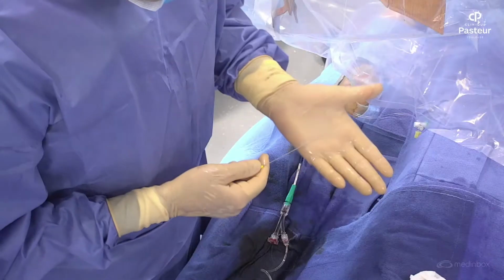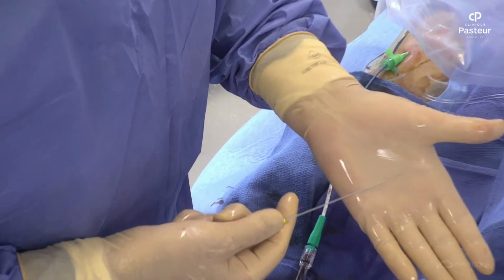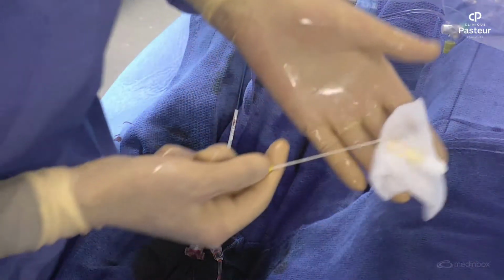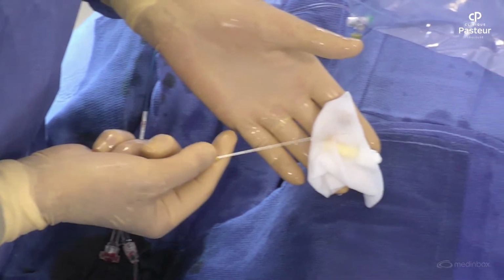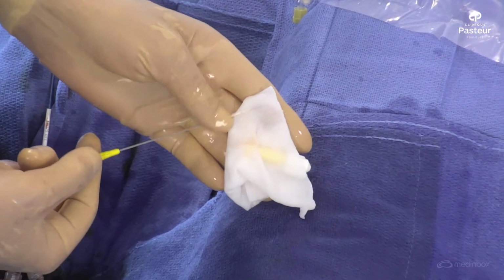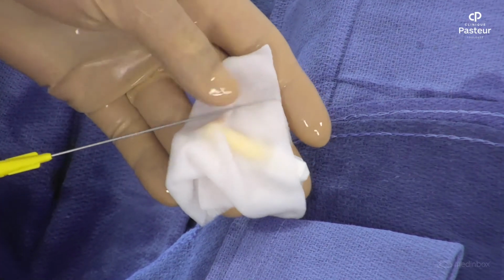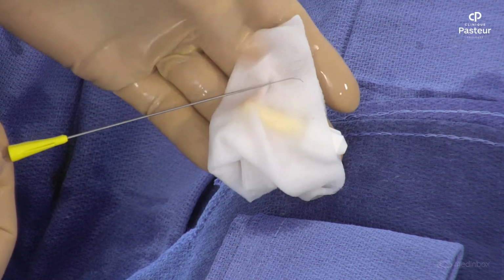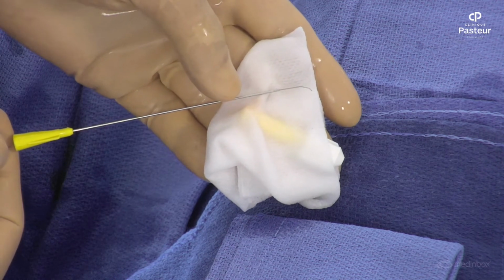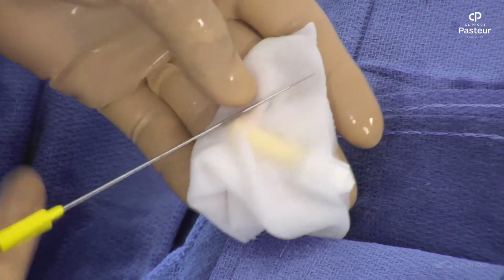I don't know if you can see the shape of the wire. Here you see the shape of the wire. In fact, there are two bends. One distal, very short, 1-2 millimeters, and the second a little bit more proximal. Okay, we will try to do that.